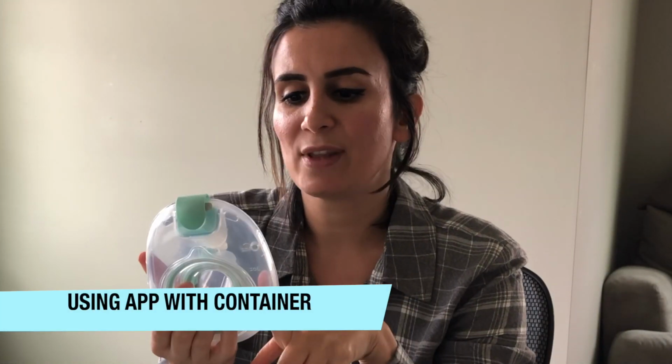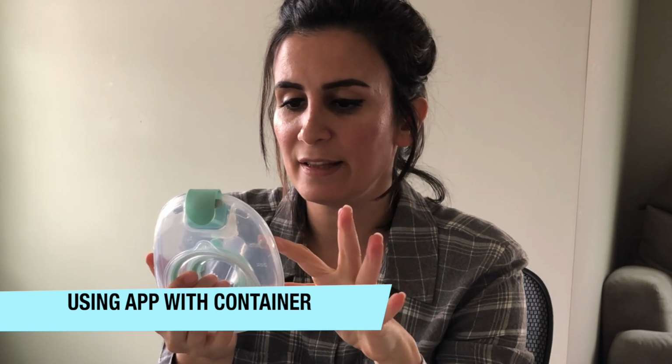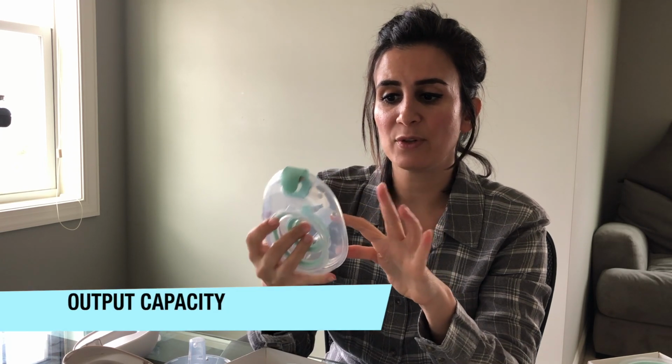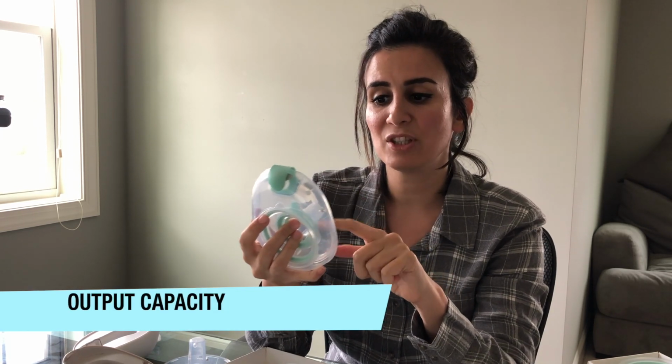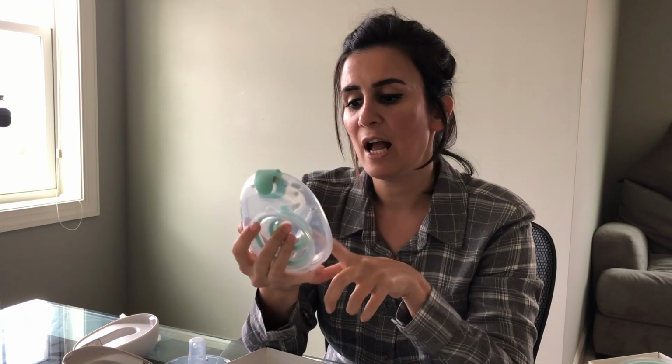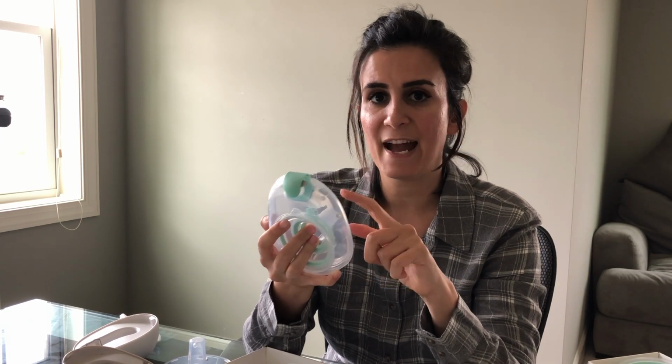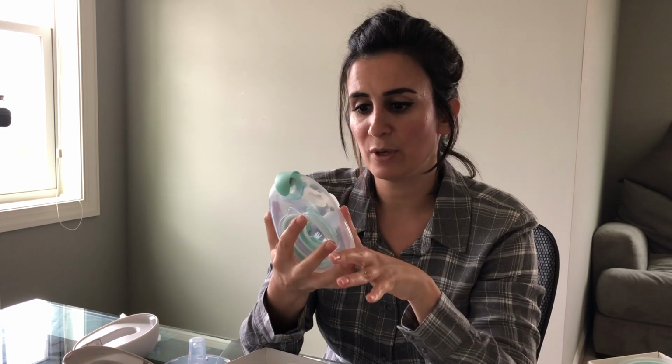Yes, you can use the app with this. Now I see the container is marked all the way up to 4 ounces, but you can actually get more. Now it just depends on your sensor how much you can actually get in here, but it can fill a lot more than 4 ounces. I was able to get 4.5 with one pump, so you can definitely fill more before the app tells you, oh, you've reached your maximum, you cannot pump anymore, and before it turns off.